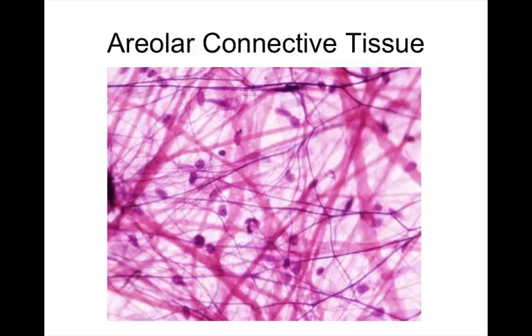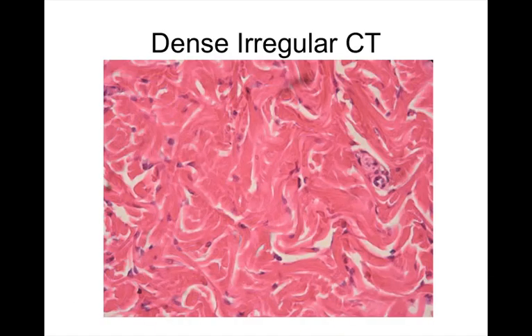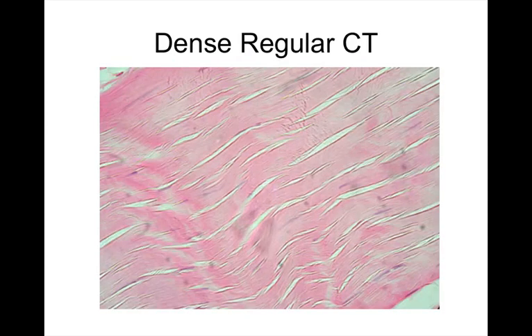And just to go back a little bit, this is when they're not packed together. So this is why we call this loose connective tissue, with all the voids. Whereas this is dense because there aren't as many voids, but it's all the same kinds of collagen fibers. This one is hazy on the screen, but you can almost get the impression of the collagen fibers being made up of individual proteins that are belted together.